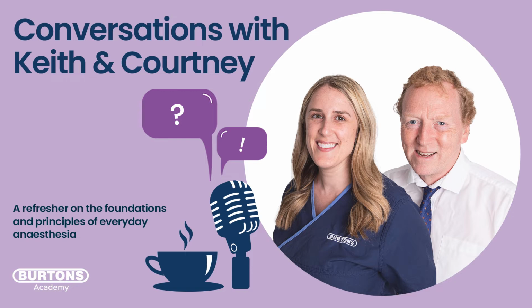Yeah. And so when we see a high end-tidal CO2, what we're basically inferring from that is that the balance is shifted, so that there's too much CO2 in the blood, there's insufficient removal from the blood, so we've got this high CO2 value. So we would need to increase our ventilation to reduce that CO2 and redress the balance. Okay, so we're using the lungs as the way to finally control and regulate the excess amount of CO2. Exactly, yes.